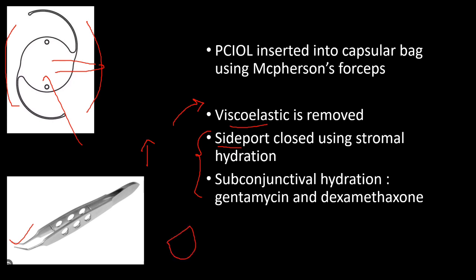For wound closure, the anterior chamber is deepened using balanced salt solution injected through the side port to help in self-sealing the incision. The conjunctival flap is repositioned using bipolar cautery. Finally, a subconjunctival injection of gentamicin and dexamethasone is given. This completes all the SICS surgery procedures.